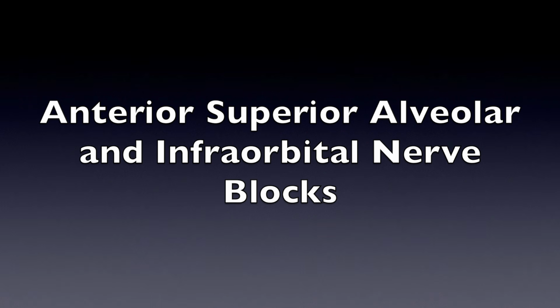To the faculty, state when you have reached your landmark. State also when you are aspirating and the results twice, which would sound like aspirate negative, rotate, aspirate negative. State also when you are prepared to deposit solution.